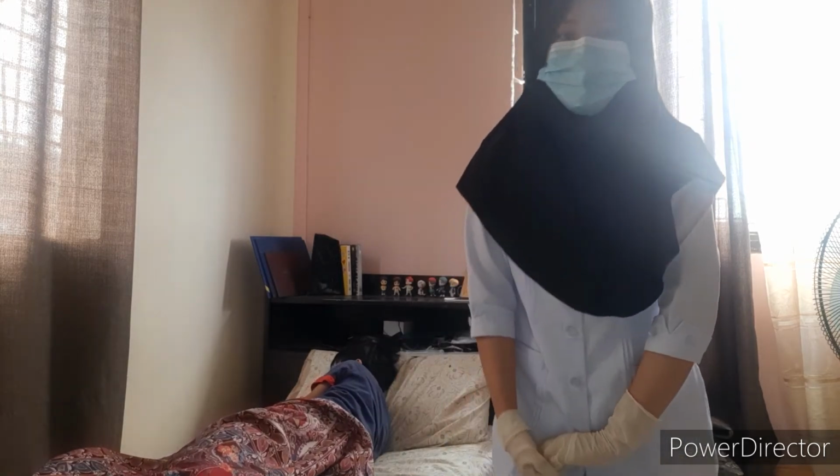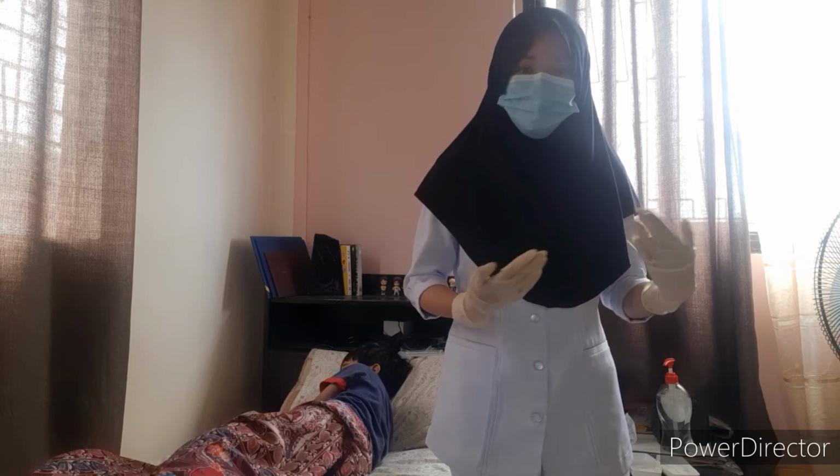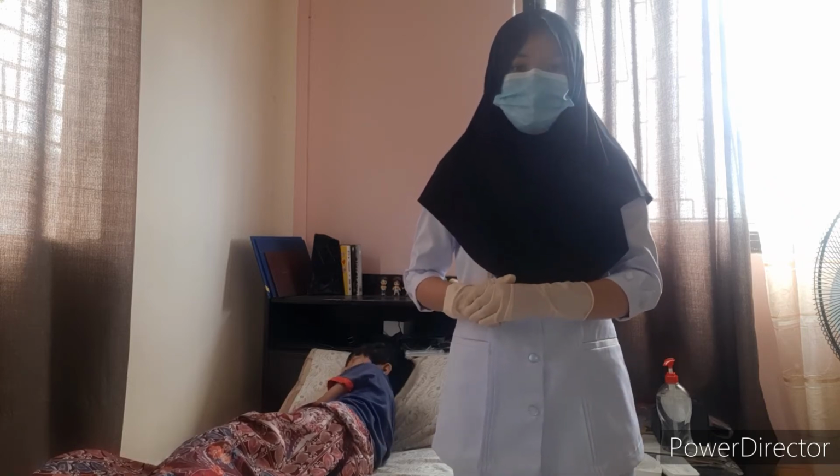And then, don gloves. So this is to maintain the standard precautions when exposed to body fluids.